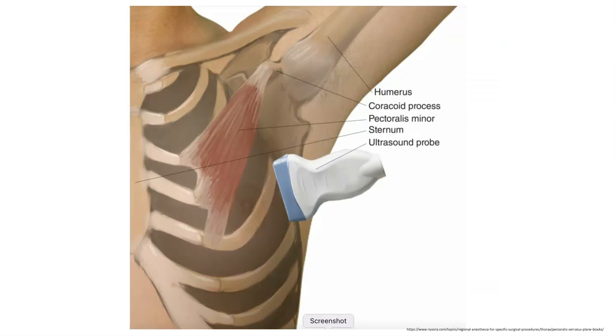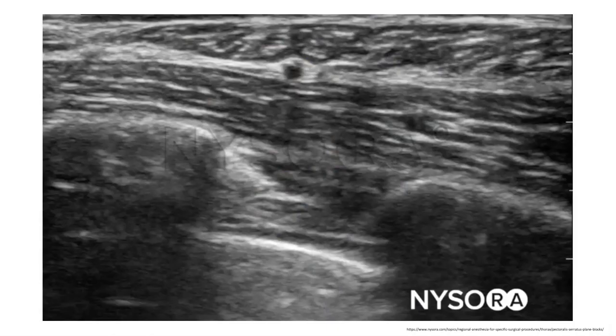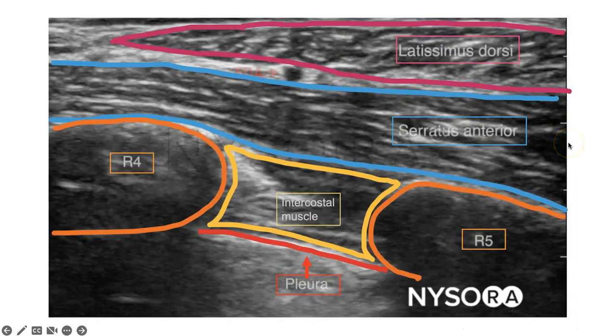This is where we're going to be putting the ultrasound probe — over ribs 4 and 5 in the mid-axillary line. When doing the procedure, we're going to be putting the needle in on the short end of the ultrasound probe, which allows us to see the needle in long axis — the entire length of the needle — so that we have the most precise control over exactly where the needle is. With the probe in that orientation, this is the ultrasound image you'll generate. We can see a rib and another rib with the pleura deep to the ribs, and then our two muscular landmarks more superficial: the latissimus dorsi muscle and the serratus anterior muscle.